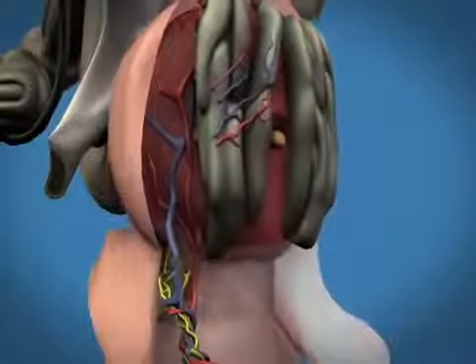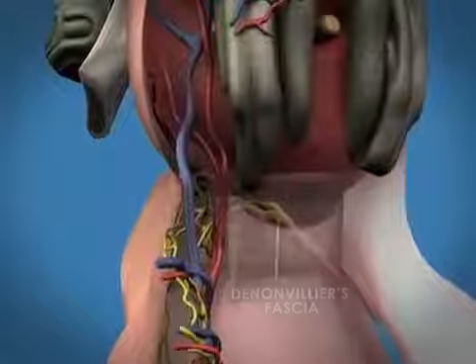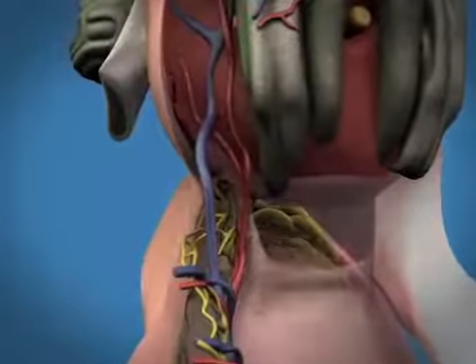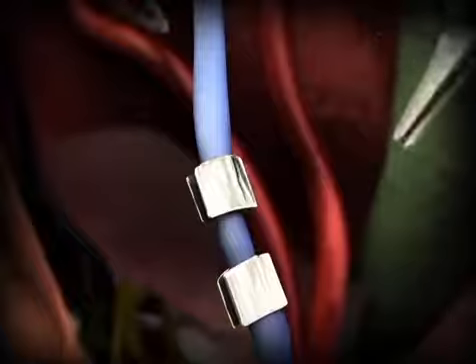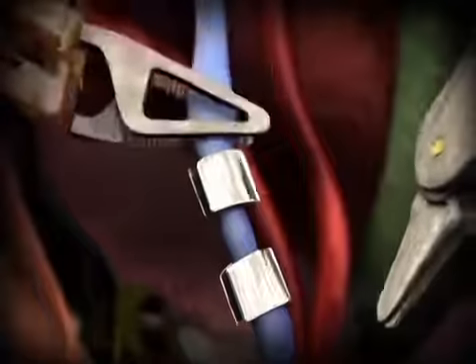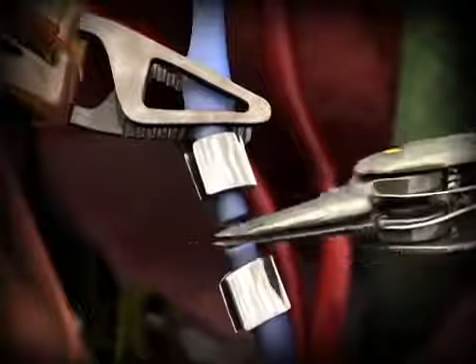The vas deferentia and seminal vesicles are then lifted up and secured to the prostate base with a stitch. The prostate is now lifted up and Denonvilliers' fascia is separated. The blood vessels in the foreground in this section are secured athermally using minute clips or sutures and cut. Here we illustrate how the robotic instruments, which are able to move in almost any direction, accomplish this.